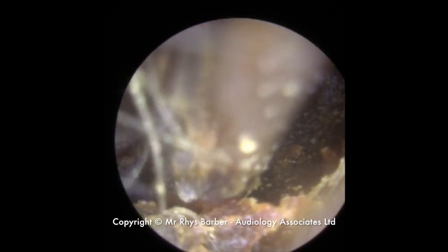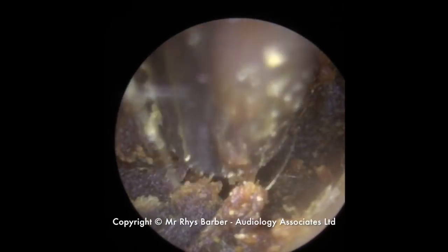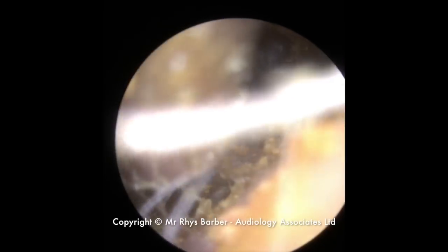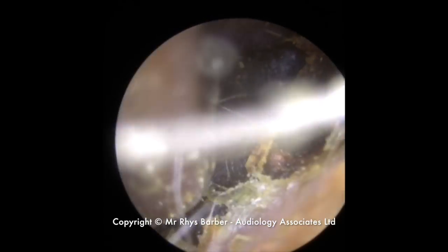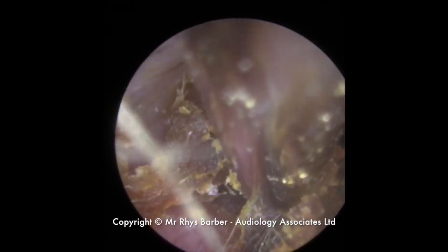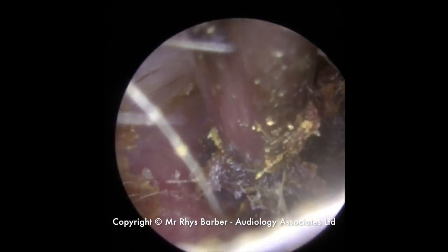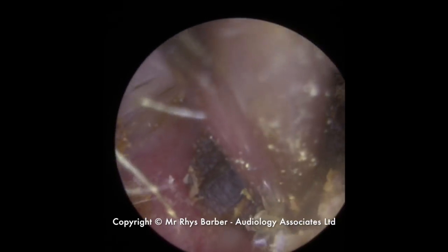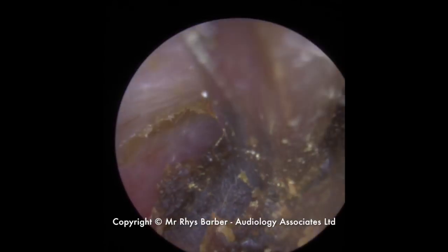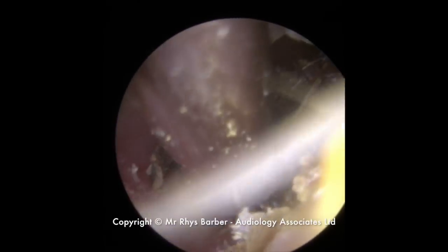And we'll do the same here at the base. You can see we're just trying to find the leading edge of this wax. There you go. Just maneuvering that wax off the canal wall. You can see just how sticky this wax is there. You can see the canal wall is just there. So if you'd used a Jobson Horne on that with that slight bump in the canal there, you would have quite easily touched that. So I'm just working on this final section of wax.